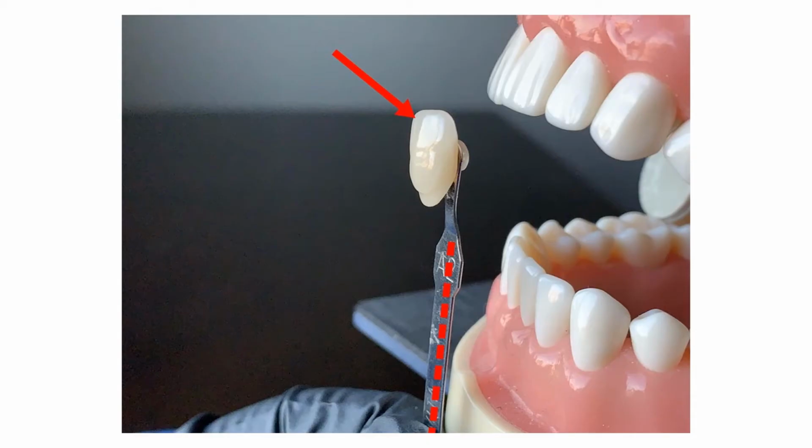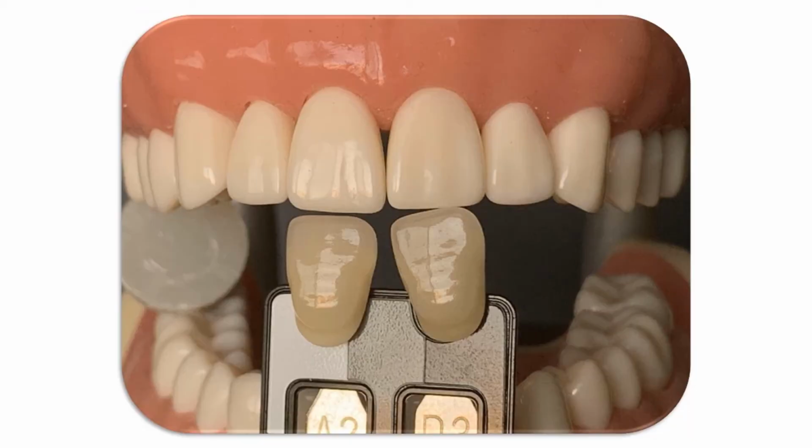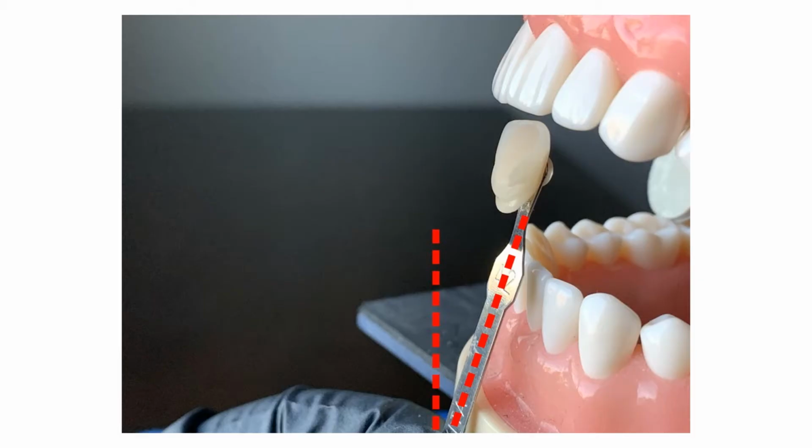Now, as we approach our patient, there's one more thing to think about with glare, and that is the angle that you hold your shade tabs to the flash, because if it's at 90 degrees, oftentimes there's unwanted glare or highlights right on the shade tabs, and you can't see the shade, nor can your lab. So what you're going to do is just tilt it in a little bit toward your patient. I'll go ahead and demonstrate that.